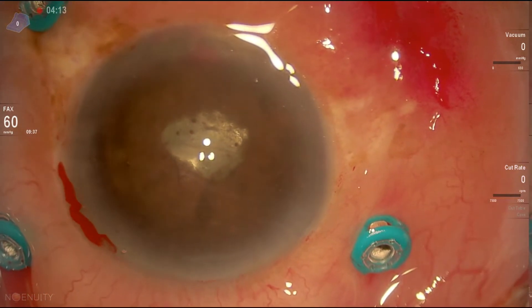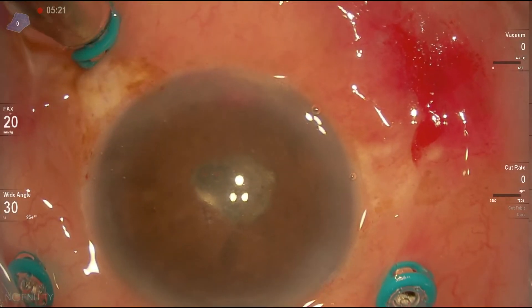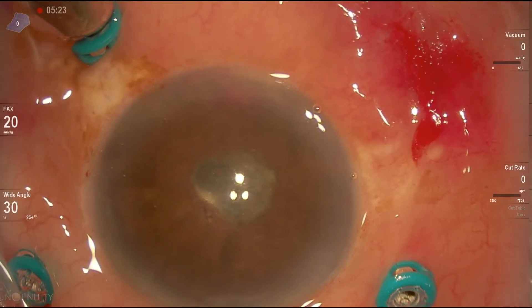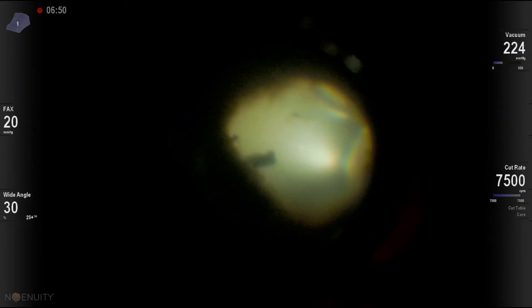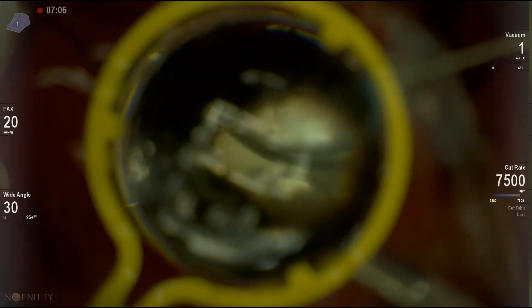Next step — very important — to make sure that the infusion cannula is definitely inside the vitreous cavity before opening it. Now we start the vitrectomy under air, and the aspiration is connected to a syringe outside.